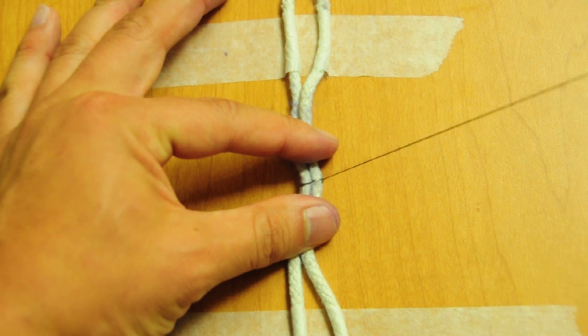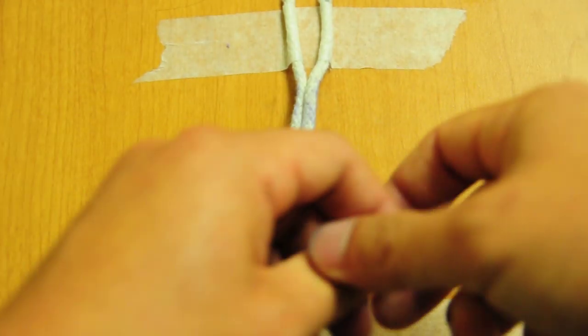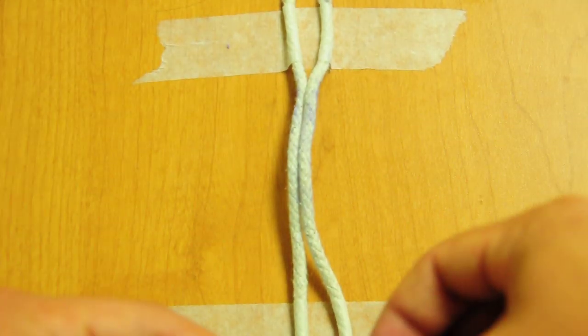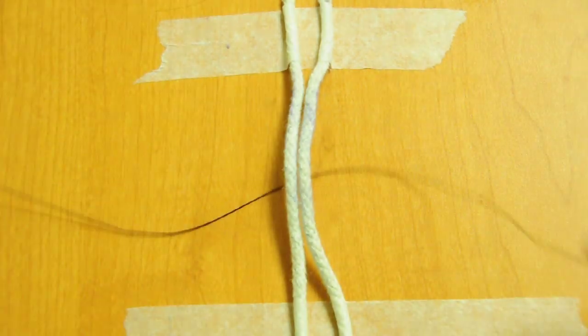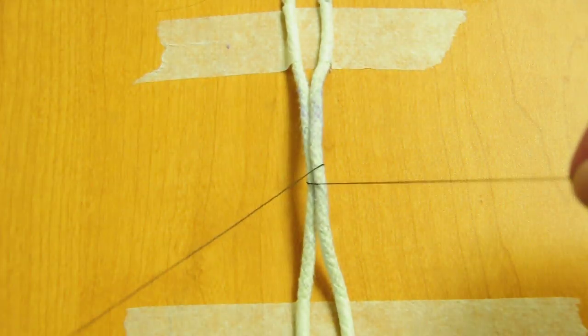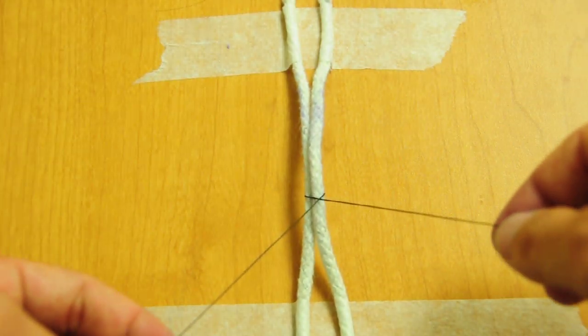Okay, or if you understand your knots, like we talked about, like Dr. Lukter and Dr. Lee like to tie granny knots on purpose. So granny knots used in the right situation are helpful.